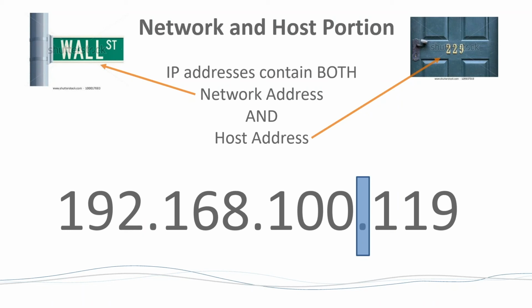It does. Yep. So you might see in the error on a switch, cyclic redundancy check failed, CRC. That means that you had a corruption in the transmission of that. So if you're getting that, you're going to check your cables. You're going to check your media. Make sure that it's good. It's typically cables.